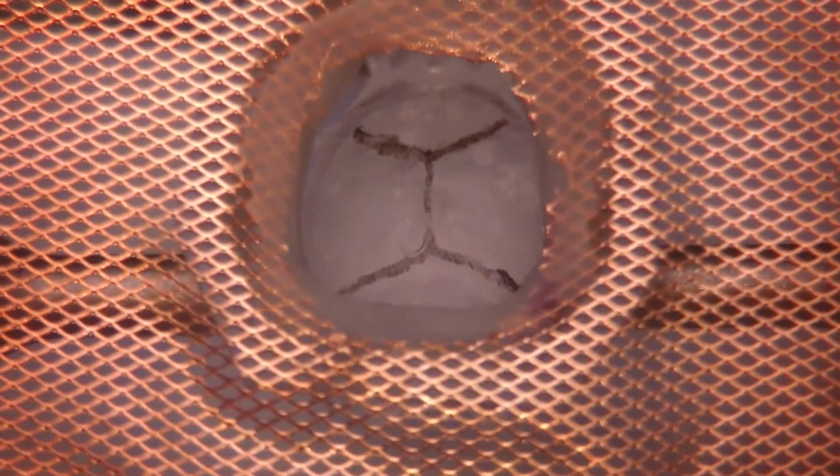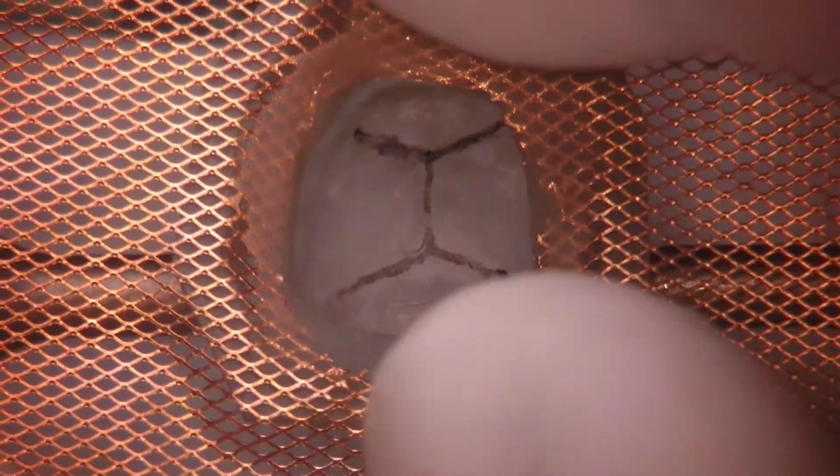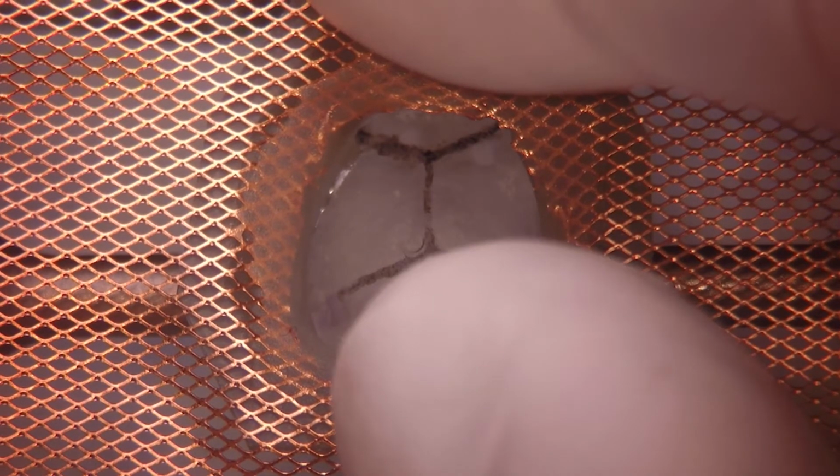And why I like the light curable cement, especially for this step, is because once we hit this cement with blue light, that you can see now, in 10 seconds, 15 seconds, it's fully cured. So you don't have to spend minutes waiting for the cement to be cured.